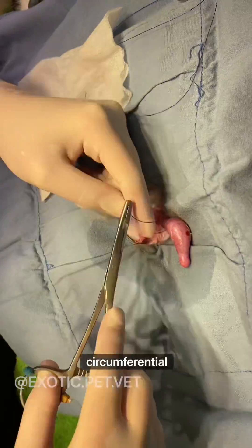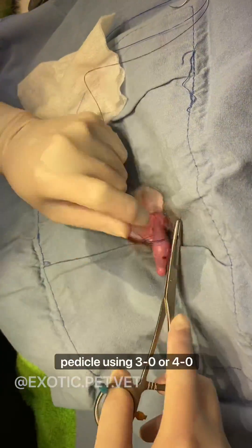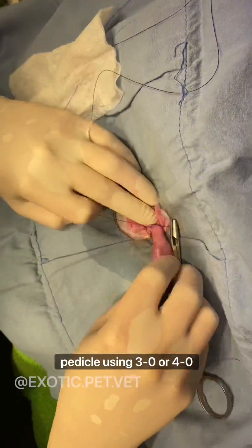A circumferential ligature is placed around the vaginal tunic at the base of the pedicle using 3-0 or 4-0 absorbable suture.